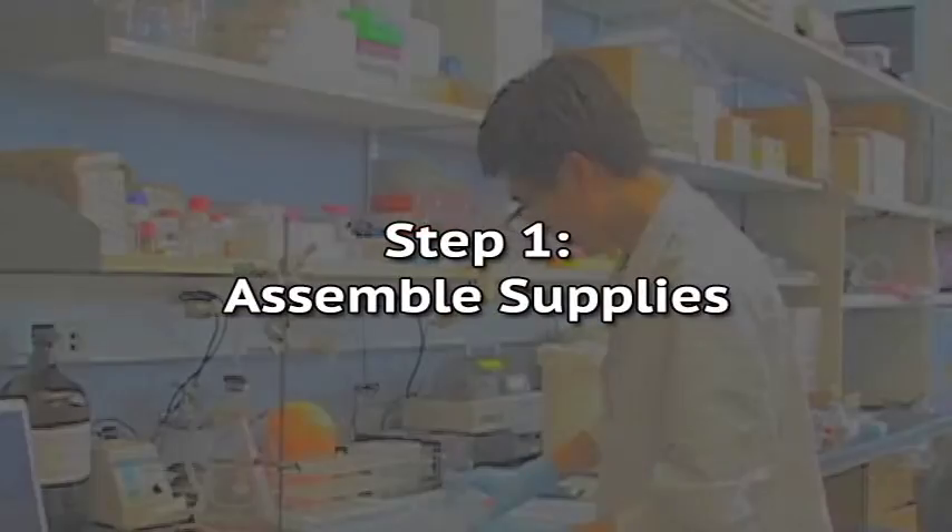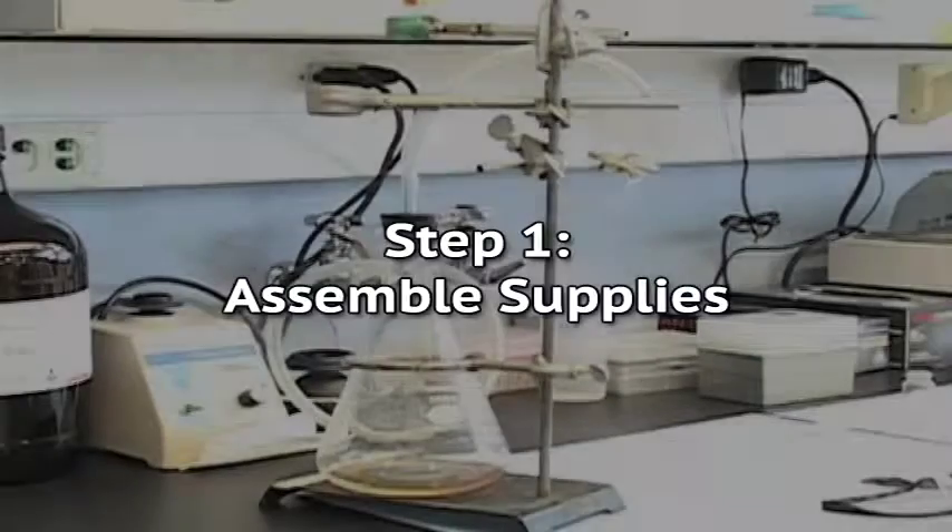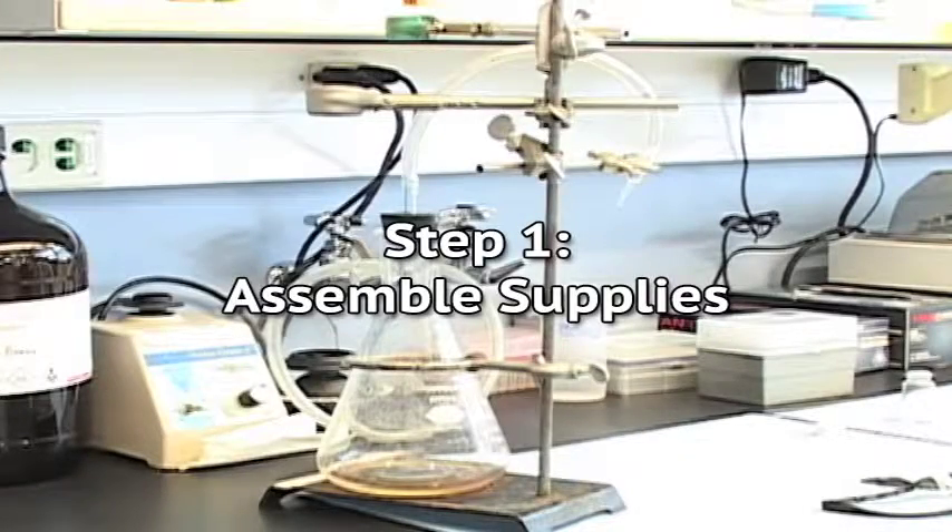Step 1: Assemble supplies. All supplies should be assembled before attempting the sample collection.